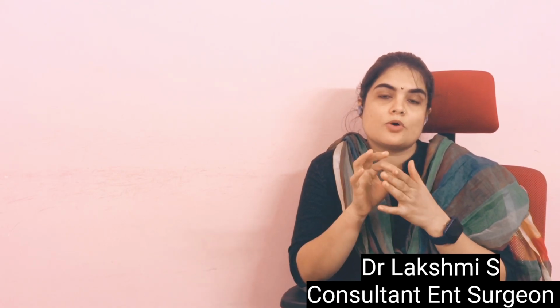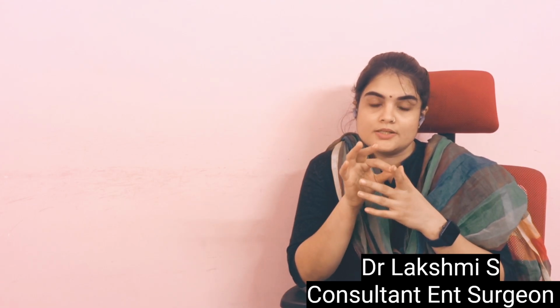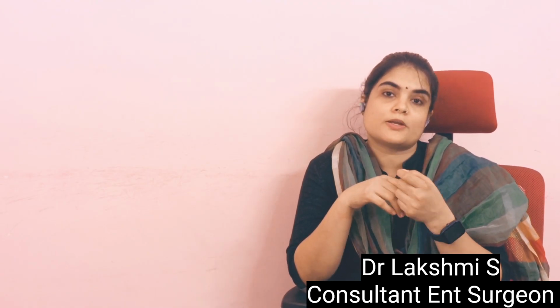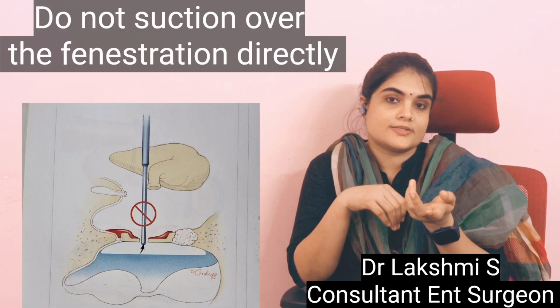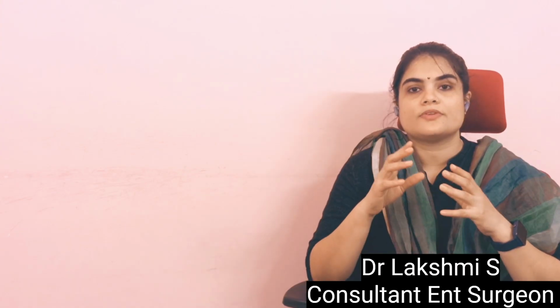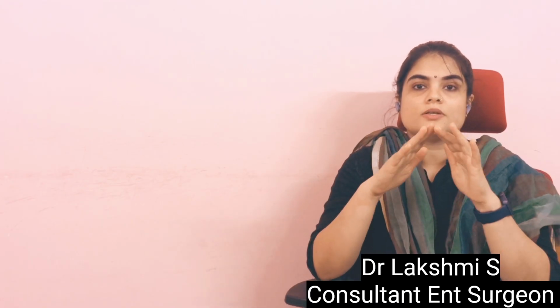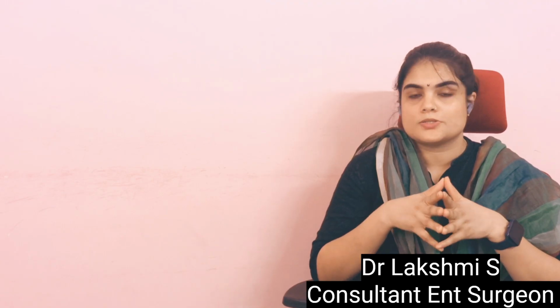Also, you can keep a small cotton ball soaked with adrenaline at the level of the oval window so that the bleeding is reduced. We do not put direct suction over the oval window, because direct suction can suction out the perilymph, and it can cause sensorineural hearing loss and vertigo and other problems. Sometimes, if the fenestration is bigger, you can use a perichondrial graft or tragal perichondrial graft around the piston so that the fenestration is covered. So that also can be done.